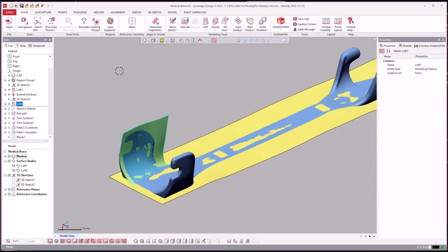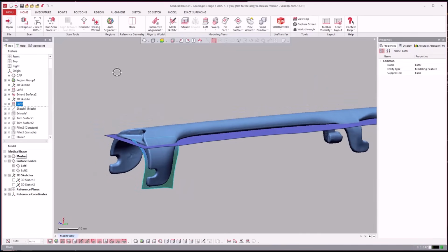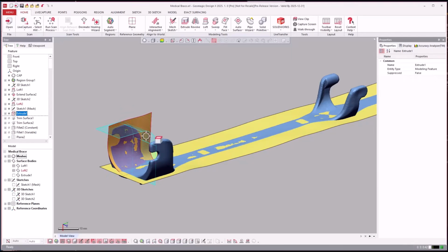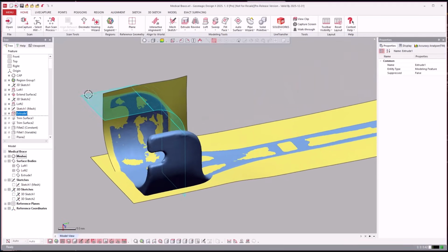Now what I like to call this approach, obviously this is a surfacing approach that they're taking, and it's an inside-outside type, is kind of what I call it. So we're going to model all the inner surfaces on this side and then all the outer surfaces and then stitch it all together is the general approach here. So it does help to have some sort of ordered fashion as to how you're breaking down the part. So they're going to model all the interior pieces, because this mates with a probe, and then all the exterior pieces too. So they went ahead and did an extrude wizard here.